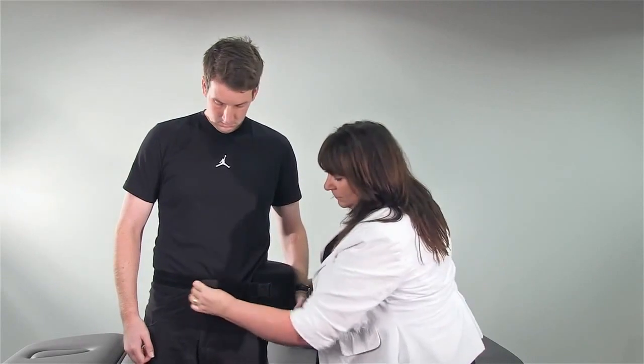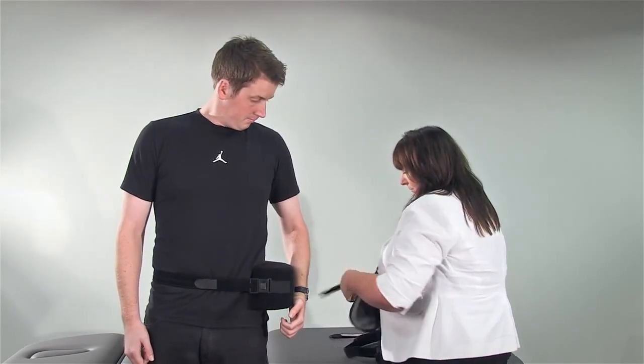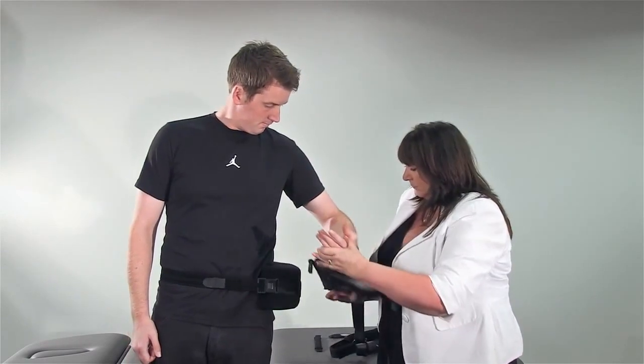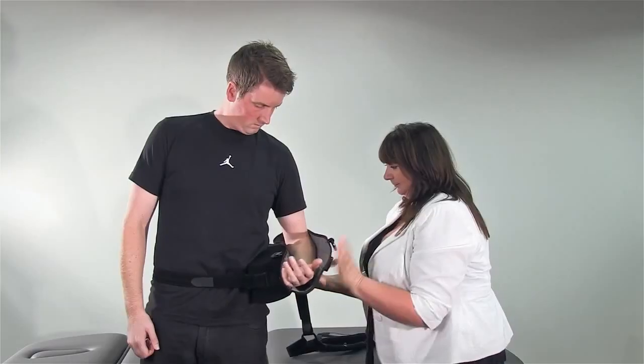The waist strap can be adjusted as required. Place the patient's forearm in the sling with the arm as far back as possible in the sling and attach to the cushion, ensuring the elbow is fixed at 90 degrees.